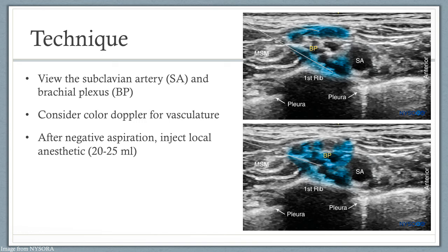Then, consider inserting local anesthetic into the superficial skin before needle insertion. After needle insertion, from lateral to medial, advance the needle through tissue layers towards the brachial plexus, considering the hydrodissection of tissue layers. This means you can inject small volumes of saline or local anesthetics to guide the trajectory of the needle path.